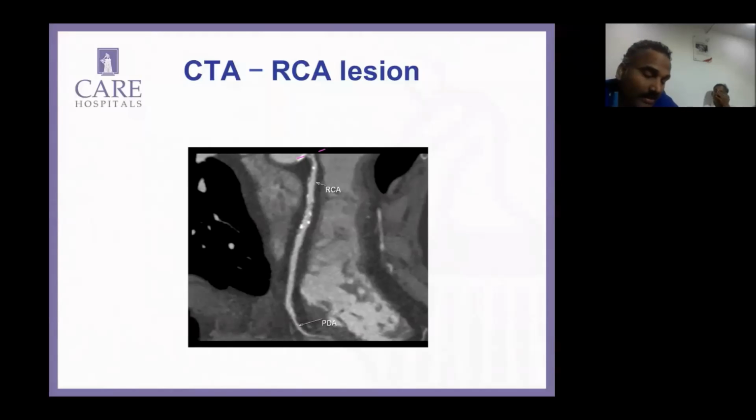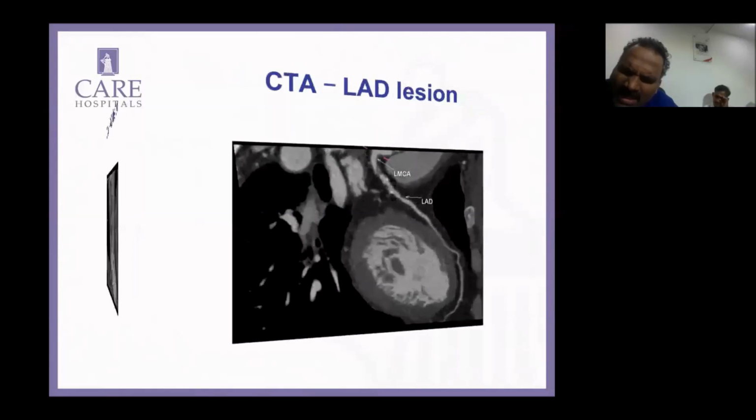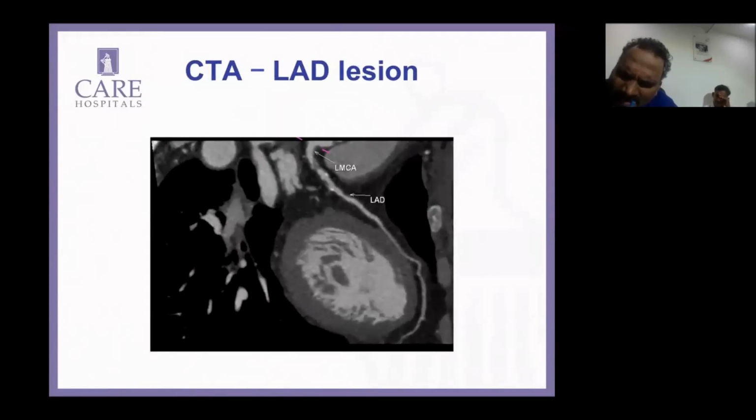This is one case example. I think I have shown it in that art of angiography presentation, where we missed it. The patient came with class 3 angina post bypass, and a conventional angiogram was done. There was a lesion in the RCA ostium, so stenting was done. Within 3 months the patient came back with similar symptoms after stenting also. So we did angio, and then I did an IVUS.